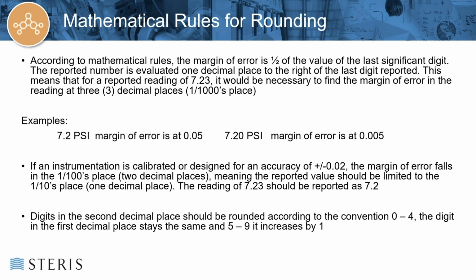Now here's an example of temperature. So we see if the specification is 50 Celsius with a tolerance of plus or minus 5, so your upper and lower tolerances. If you put a false sense of accuracy and precision into the lower control limit and upper control limit, you'll see that one company established an upper limit of 55.4, a lower of 44.5, and in reality, it's not going to make a difference.